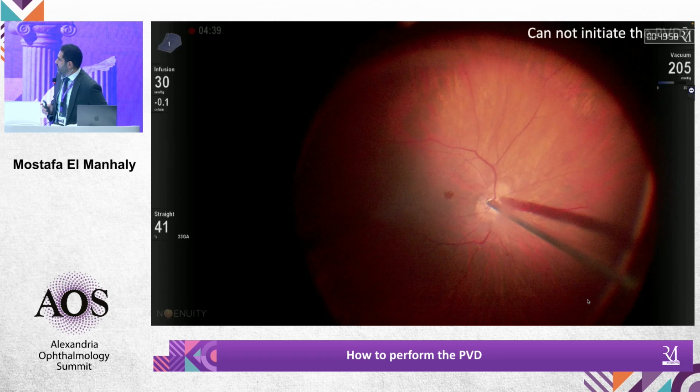Dr. Ehab, would you like to add anything? Just a quick comment. The cases that you show about debulking the vitreous when you have hemorrhage, I usually like to keep the vitreous intact until I aspirate the hemorrhage.